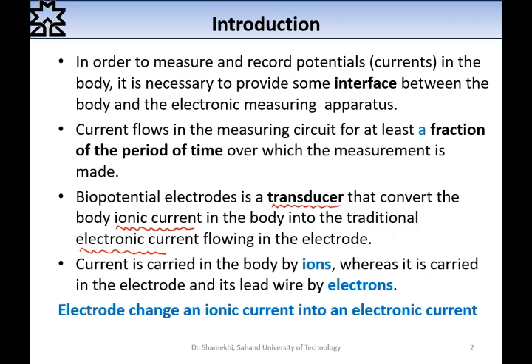Current is carried in the body by ions, whereas it is carried in the electrode and its lead wire by electrons.